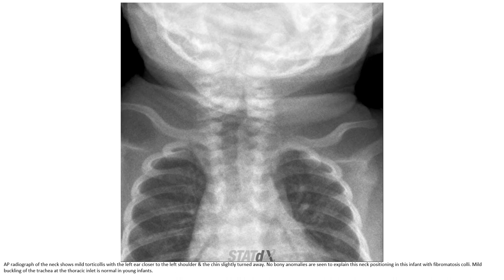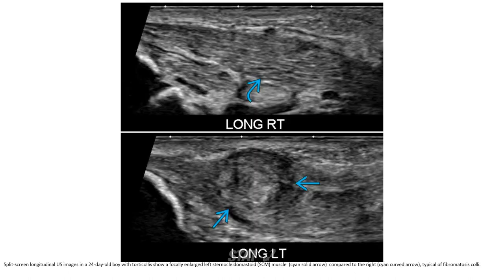This is the clinical presentation of the child with the left ear close to the left shoulder and the chin slightly turned away — consistent with torticollis. This is the ultrasound image in a patient with enlarged left sternocleidomastoid muscle compared to the right, typical of fibromatosis colli.